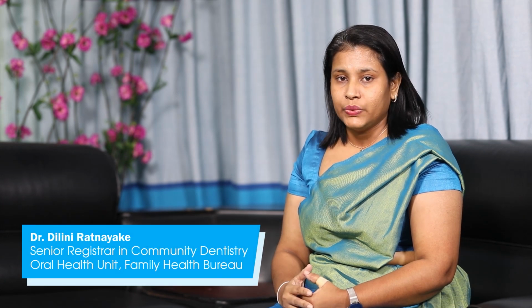The first permanent molar erupts into the oral cavity at the age of 6 to 7 years. It is the eldest tooth in the mouth and therefore is exposed to the oral environment for a longer period of time. The deep pits and fissures of the molars make them more vulnerable to dental caries. Application of fissure sealants along the pits and fissures will form a physical barrier between the oral environment and the occlusal surface of the tooth.